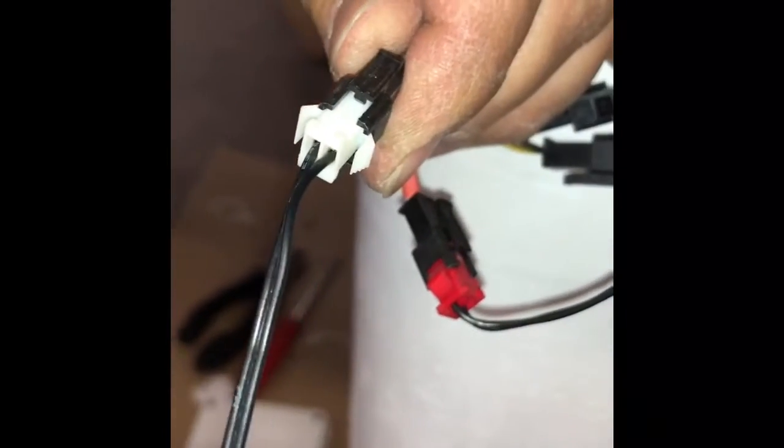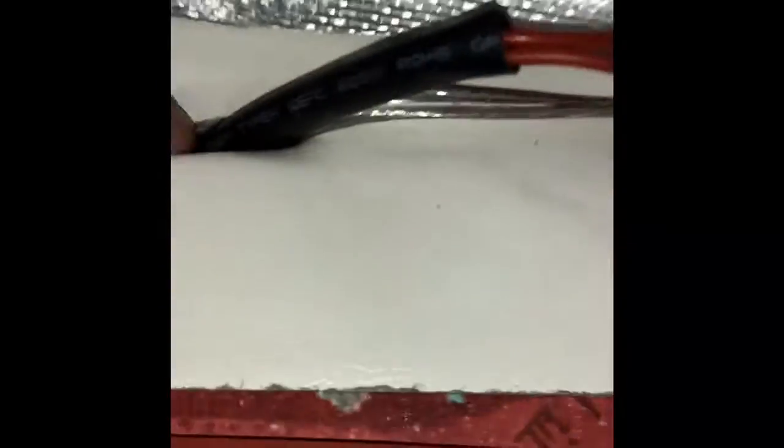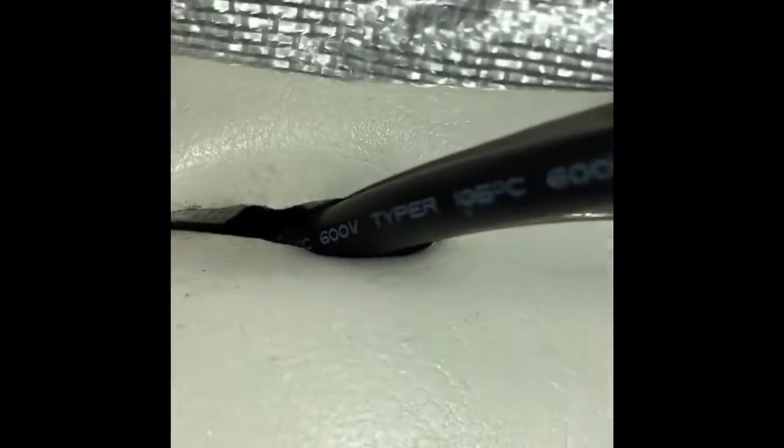Make sure when you guys are putting it back in there, make sure they are lining up correctly, and you do not need to put any force. It goes in very smoothly. So if it's not going in there, then it's not lining up correctly. And what you're going to be doing is you're going to go ahead and put the cable back in there, the sensor, the thermal fuse. And again, it's going to come up the same way that we pushed it down for it to come out.